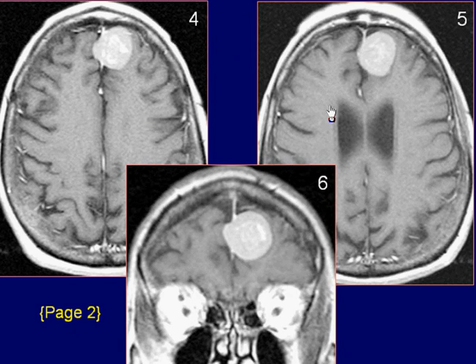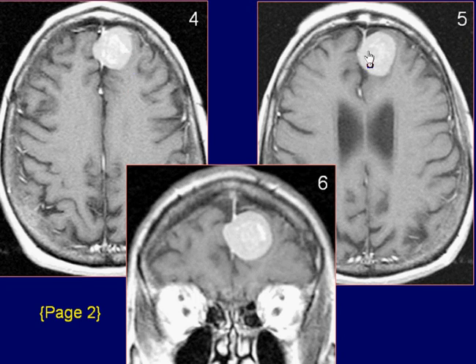Axial and coronal post-gadolinium T1 weighted images demonstrate intense and homogeneous enhancement of the lesion. Also noted is enhancement in the falx adjacent to the lesion.